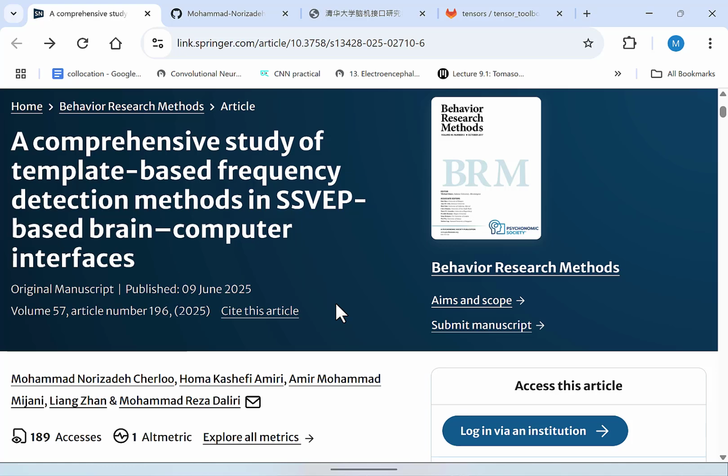For evaluation of the methods, we used the SSVEP benchmark dataset, which is a 40 class dataset and was recorded from 35 subjects. So these codes for each method are implemented based on this dataset. If you want to use these codes, I highly recommend you first use the codes for the SSVEP benchmark dataset. Then, after you get familiar with the code and with everything related to the approach, you can easily customize it for your own dataset.